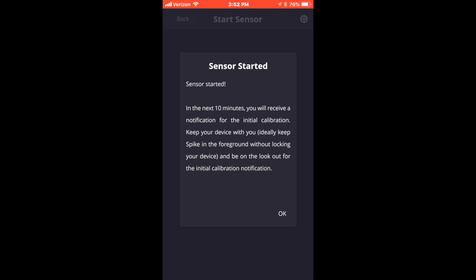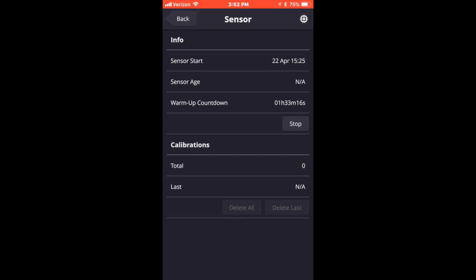It'll tell you about the 10-minute warm-up window and that you'll get some calibrations after. Go ahead and click OK. If you follow these steps you will be able to initialize your Spike app with your NightRider and have it run correctly. In this recording I also show you where you can set your watch up or how to see readings on your phone.